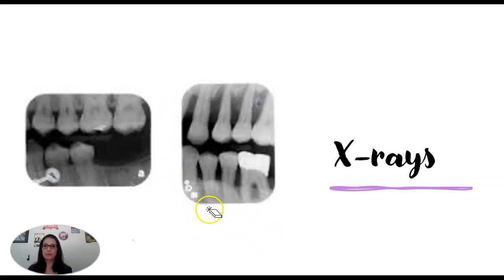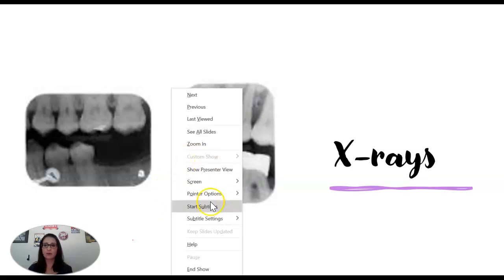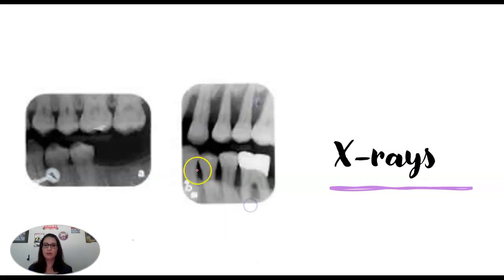And that way we're able to, again, determine where the bone level is on this patient. We can clearly see that along this canine here, there's some bone loss. There's definitely some bone loss going on. Bone level should typically be roughly about right here. And for upper, should be roughly about right there.